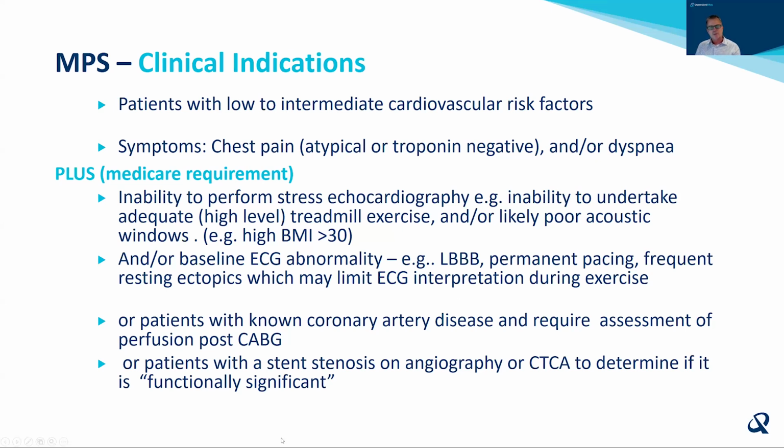Another subgroup that we can do MPS on from a Medicare point of view are patients with known coronary disease and they require assessment of perfusion post-CABG, or if they've got a stent stenosis on angiography or CTCA, and you want to determine if it's functionally significant.